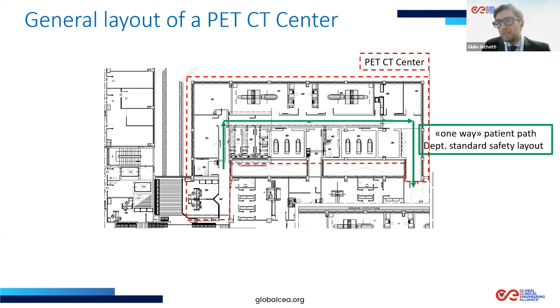In this way, for sure, the distribution of each space is coherent with the kind of action that you have to do on the patient, and above all, the safety of both patient and operator is optimized.